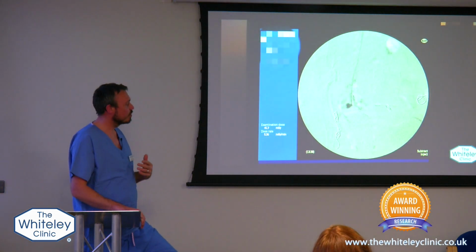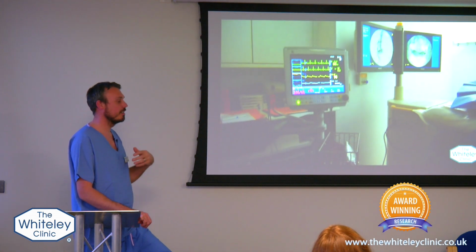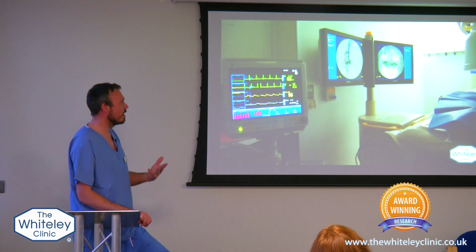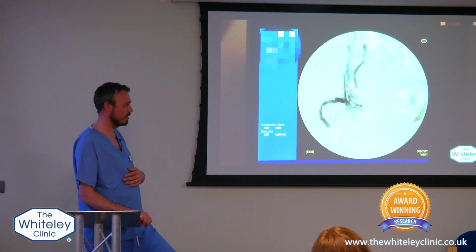And it's very much just standard practice that we embolize the pudendal vein, we embolize the obturator vein, and if they're abnormal, obviously, on the transvaginal scan, we embolize the ovarian veins. They're the routes, and they're the veins that we try to embolize with a combination of coils and STS.